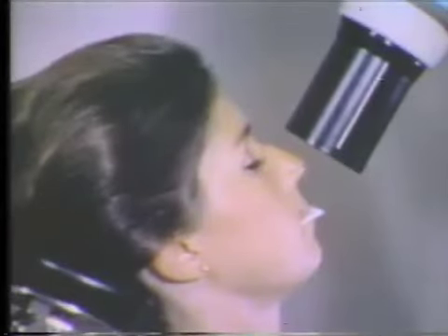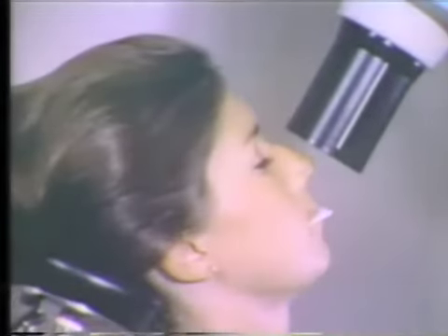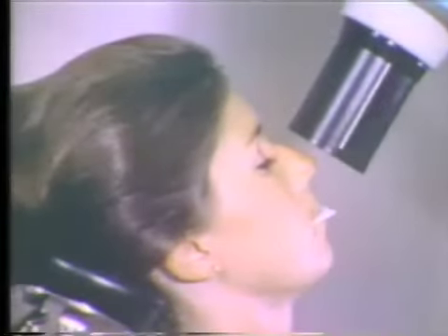Another common error is illustrated in this film. Note that the length of the incisor teeth is excessive, and the teeth are elongated. The vertical angulation of the beam was wrong. Usually this occurs because the patient's head position was incorrect. Note in this view that the ala tragus line is not horizontal. So even though the X-ray head is correctly angulated and aligned, the projection is a failure.